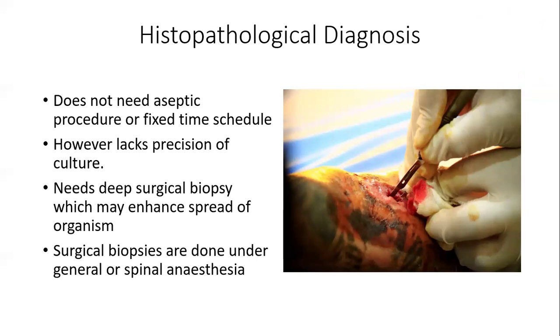It does not need aseptic procedure or a fixed time schedule. However, of course, a disadvantage is that it lacks precision of culture. And also it needs a deep surgical biopsy. And I think this was mentioned in one of the sessions by Professor Fahel, that we cannot do a punch biopsy. It needs to be a deep surgical biopsy. And this actually might enhance spread of the organism.